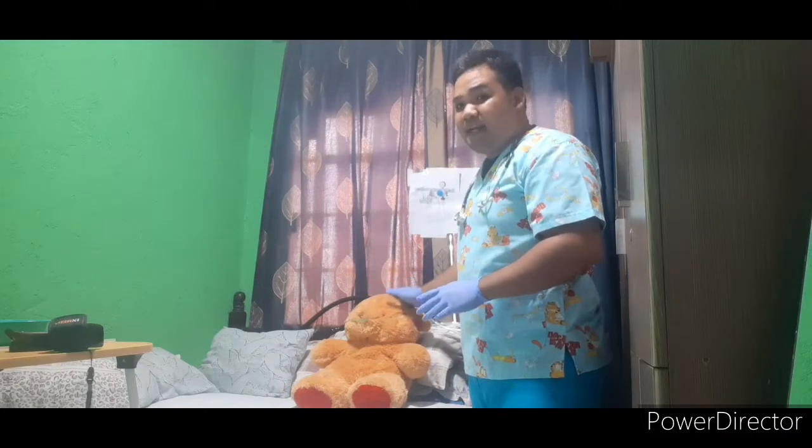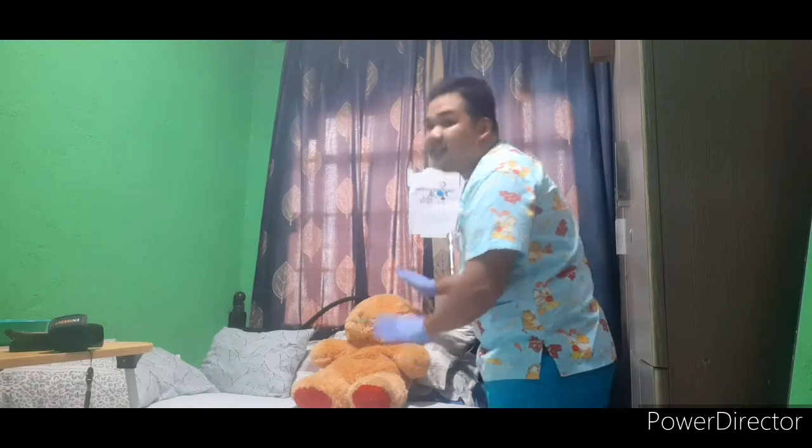After gathering the equipment, we are going to turn on the machine. But before turning on the machine, we will first ask the patient if she has had facial surgery or any facial trauma. After asking the patient, we will elevate the bed 45 degrees or turn her into a semi-Fowler's position to improve lung expansion and breathing. Once the patient is in semi-Fowler's position, we will turn on the suction machine.